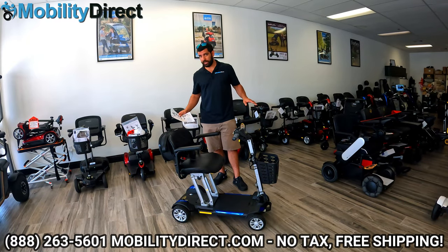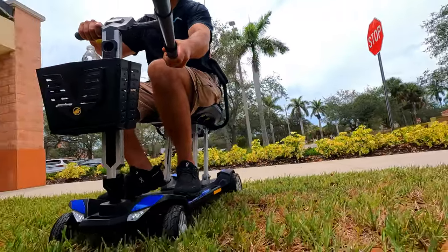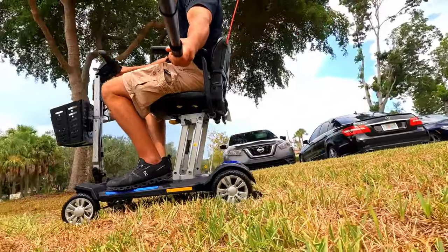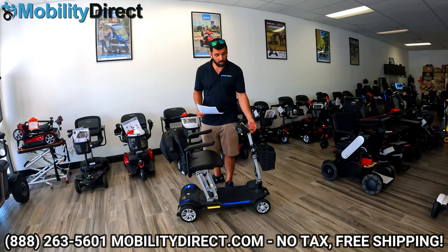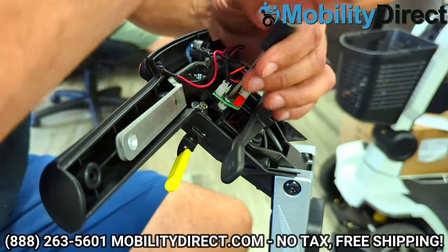This is our top-selling unit and we barely get any calls for repairs on this thing. It's built very, very well. It doesn't have a bunch of weak points and delicate parts. And if you do happen to need parts, it's super easy to work on. Everything that you need to ever think about repairing is right here in the dash. It opens up with a few screws, and the technicians are able to get these in and out really quickly.